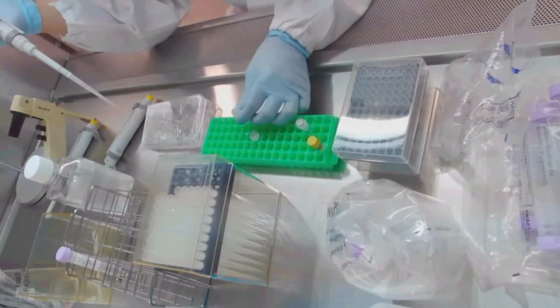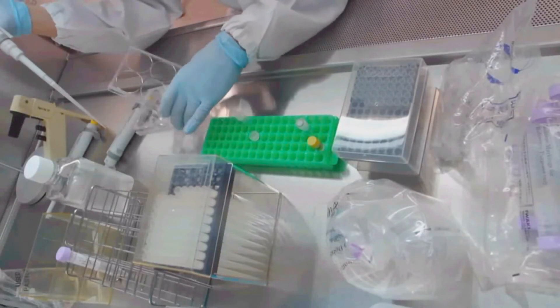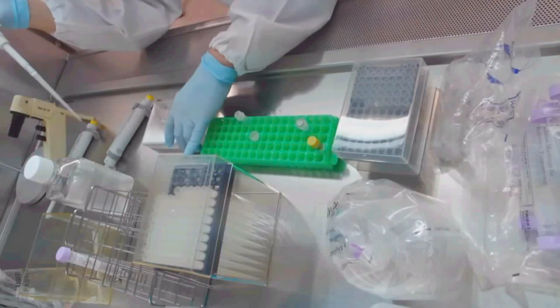Then, PBS in the well is replaced with 1.5 mL of StemFit medium supplemented with Y27632.